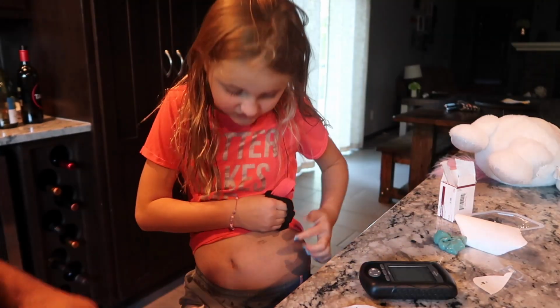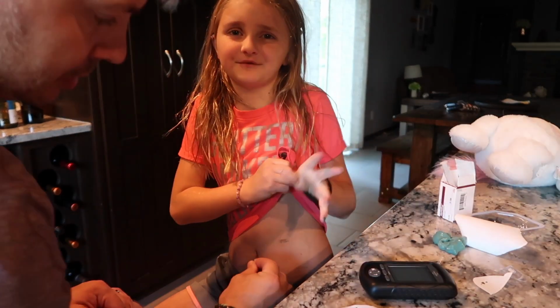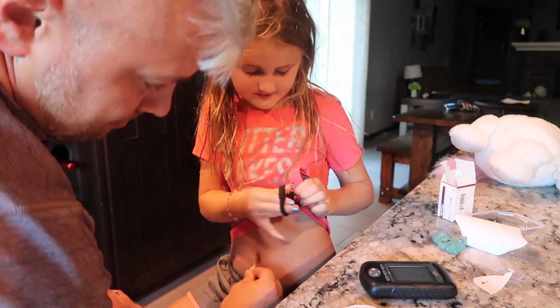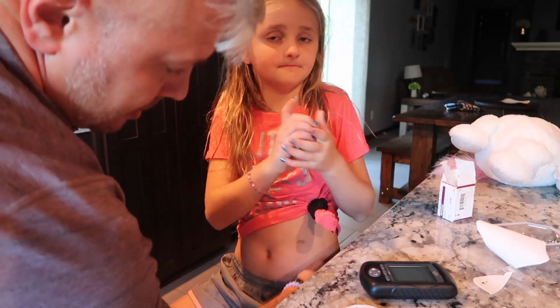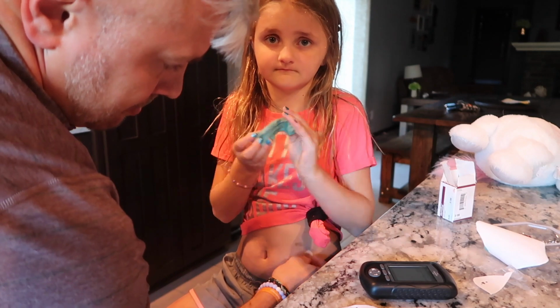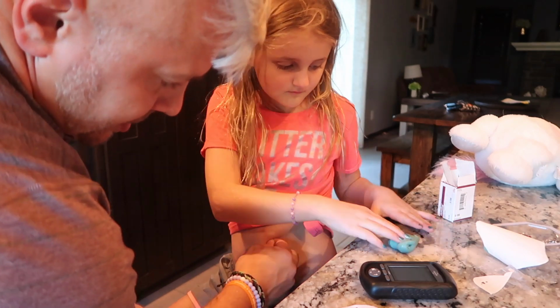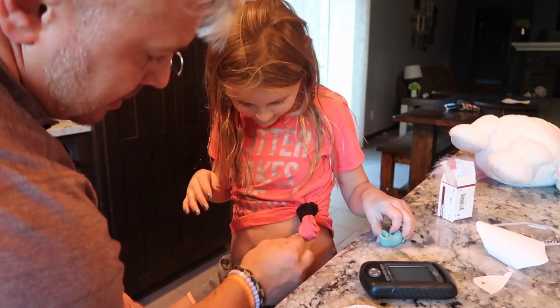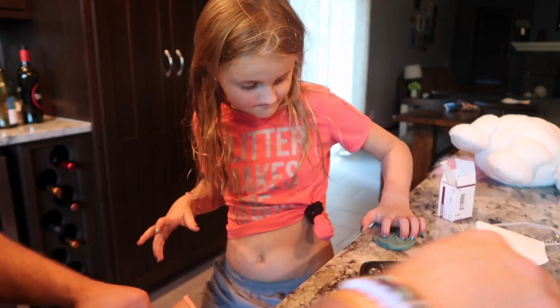All right. So where are we putting it? Leg? Tummy? I say we go to your leg. No, you want to go in your tummy? Okay. This way. Put on an arm. Keep your arms up now. Trying to get some of this goop off there from the last one. Maybe we should have hit this with Unisolve first. No, it's fine.